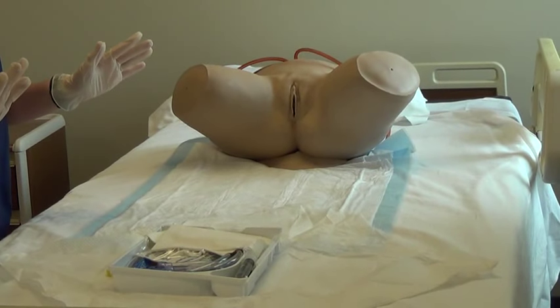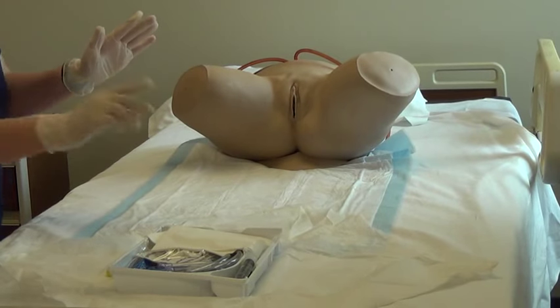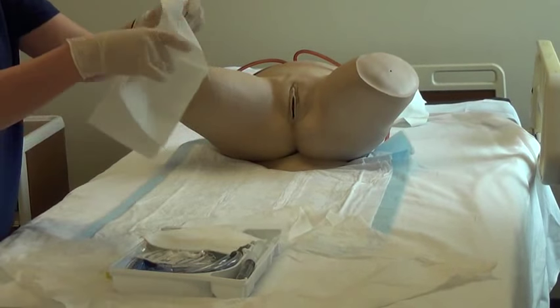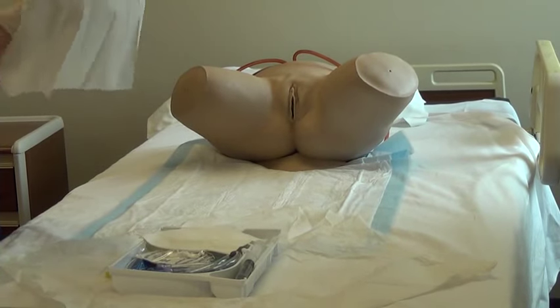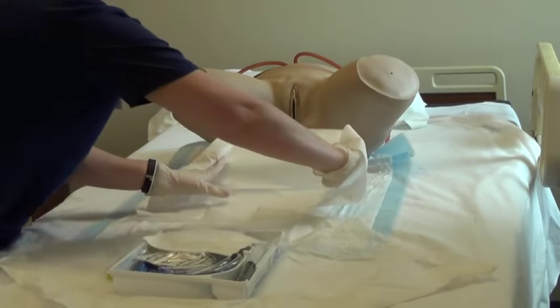Maintaining sterile technique, place the underpad up to or slightly below the patient. Do this carefully so as not to contaminate your sterile gloves.